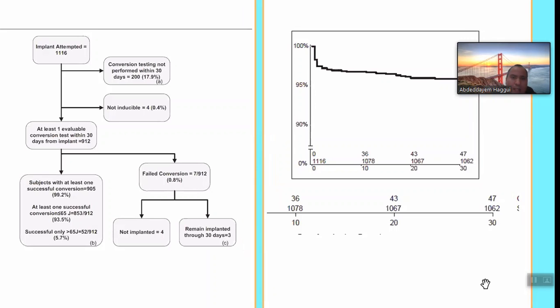Now, the UNTOUCHED study. This study aimed to understand outcomes with the new generation of S-ICD in primary prevention patients with low ejection fraction. This study demonstrates high efficacy and safety with contemporary S-ICD devices and programming, despite the relatively high incidence of comorbidities in comparison to earlier S-ICD generation trials.